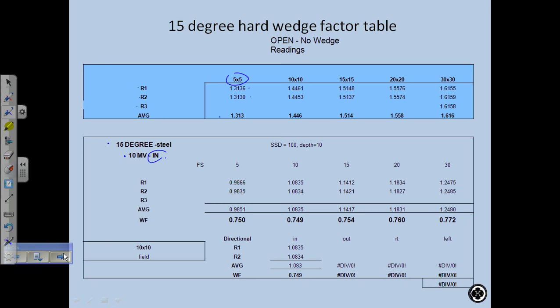Fine when I actually have the wedge, because the little wedge has right, left. But when you're treatment planning, you're going to put a right wedge in, and you're not looking at the wedge. You're just saying right, left, in or out. So you need to know what direction that is. If your gantry's on the AP, it's easy to visualize the gantry sitting there, and you say, okay, I'm going to remember that the toe is on the patient's right, and I put a right wedge in.